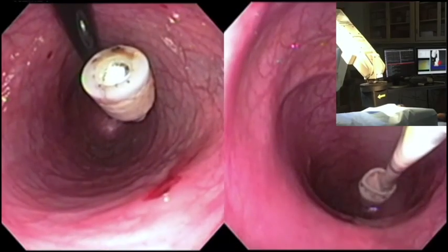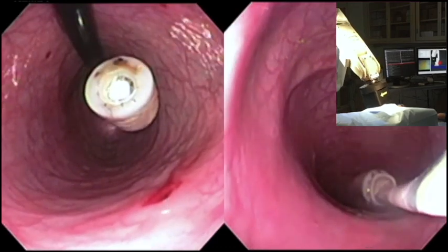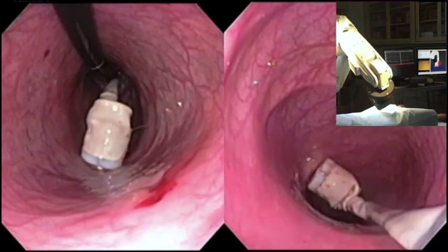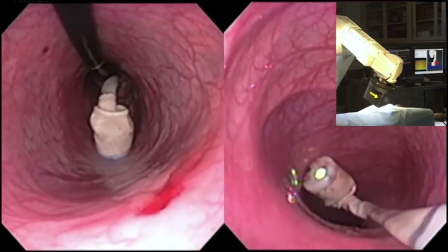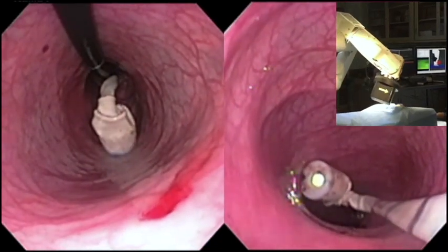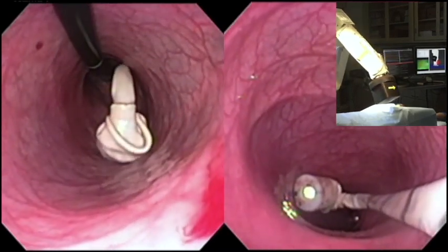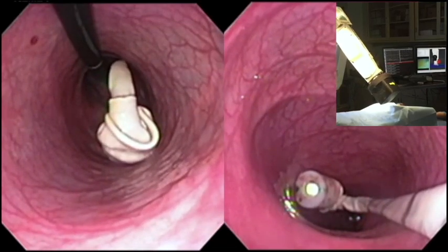Here, we demonstrate autonomous retroflexion in an in vivo porcine colon in real time at the push of a button by the endoscopist. This is similar to the autopilot feature utilized in air and automobile travel. The maneuver was successful in all 30 trials and there were no adverse events.